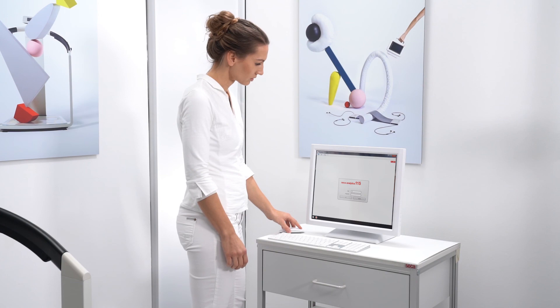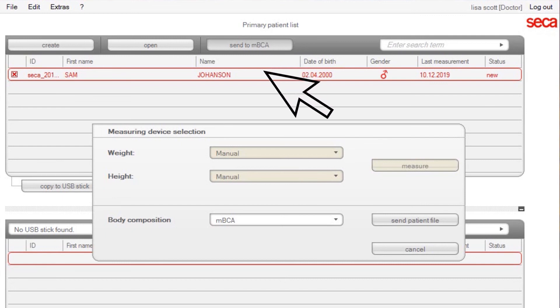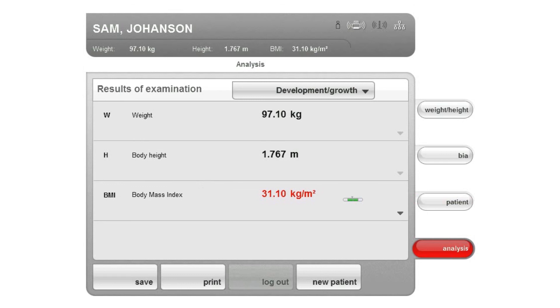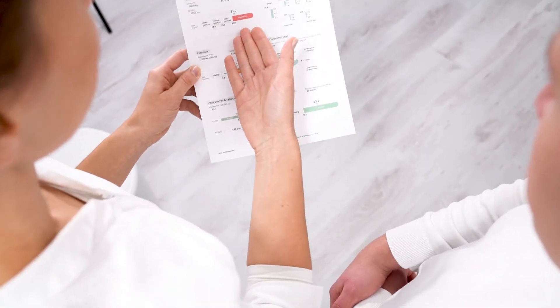Alternatively, you can also provide a file from the PC software. Start the PC software Seka 115 and perform the following steps in the main test subject list. Select the desired file and click Send to MBCA. If several Seka MBCA devices are connected to Seka 115, select the MBCA to which the subject's file should be sent, then click Send. The subject file is transferred from the PC software to the Seka MBCA and appears on the Patient tab. Confirm the data that appears on the device display; otherwise it will be discarded after a short time. The measurement is now assigned to a record but not yet saved. Save the measurement so that you can also access the results in the future. If the device is connected to a PC printer via the PC software, you can initiate a printout of the result report directly on the device by tapping the Print button.